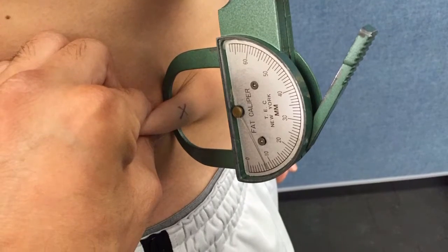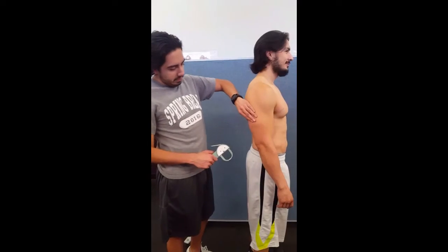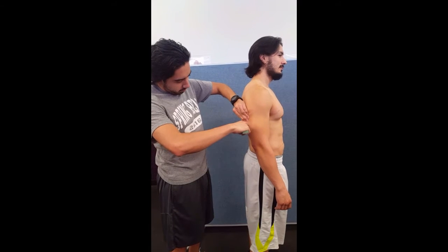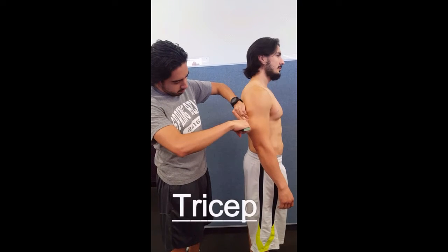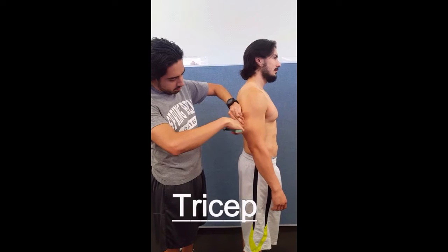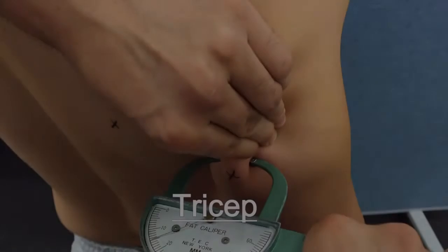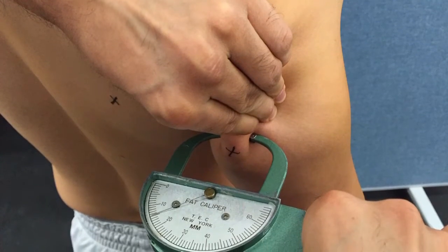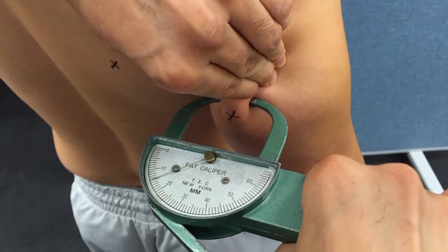Staying on the right side, we will proceed to the tricep. It is a vertical fold on the posterior midline of the upper arm. It is a measurement taken halfway between the acromion and the olecranon processes, with the arm held freely to the side of the body.